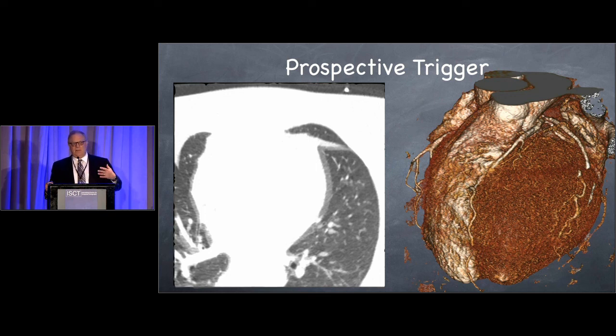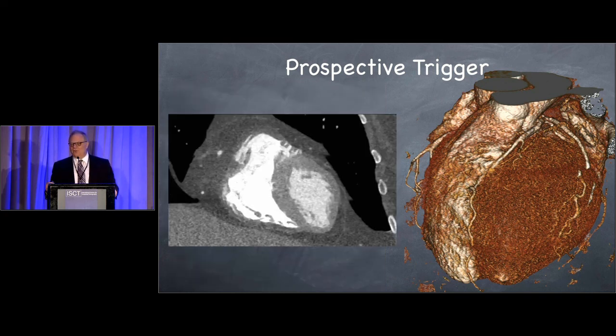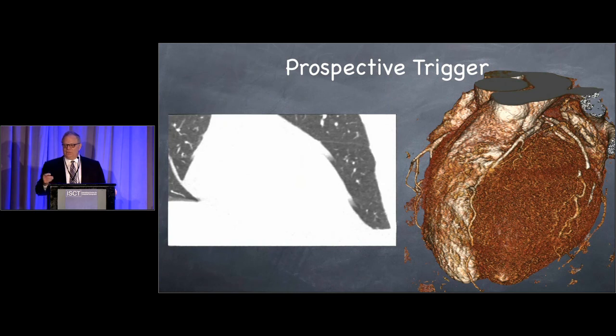This is an example of a patient who just couldn't hold still during the scan, and even though everything seems to be favorable, the fact that it took 6 seconds was just too long for this particular patient, and that results in this misregistration that hopefully you can see at those 3 levels, which is the interface of each of the scans.